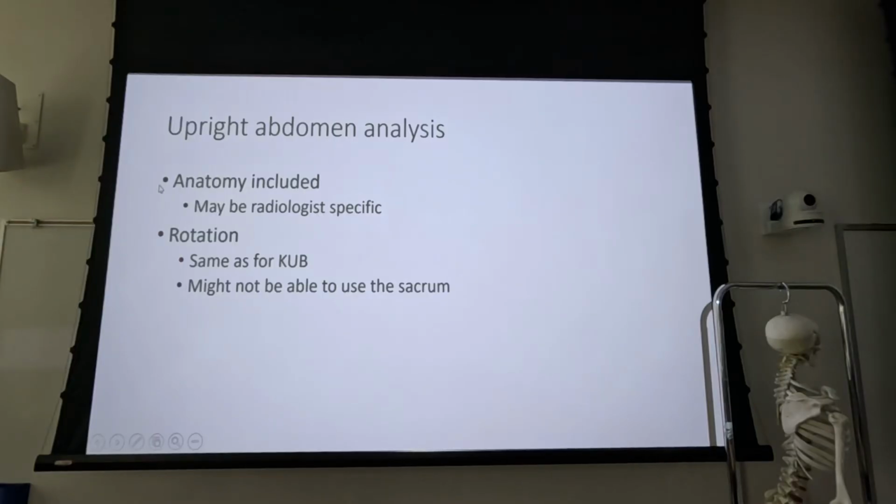So upright abdomen, the anatomy included, make sure you know the radiologist that you're working with. Some radiologists want to see the symphysis pubis on upright abdomen.